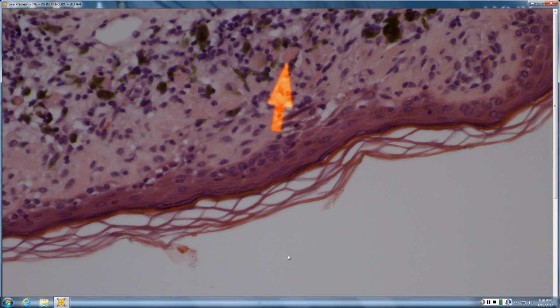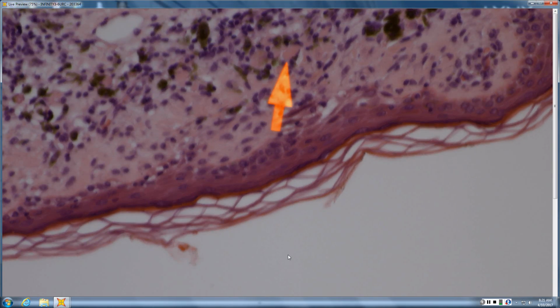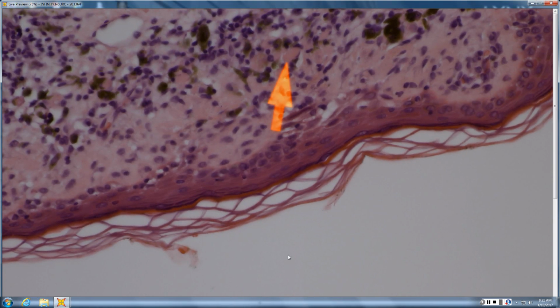So this is a late stage of a lichenoid dermatitis. Tell me things that can cause a late stage of a lichenoid dermatitis. Lichenoid GVH. What else? Lichenoid regression of melanoma, if it's broad on sun-damaged skin. What else? Like an old ashy dermatosis, something like that. An old ashy dermatosis, which is basically the same as lichen planus actinicus. What else? Like a burnt out LP, burnt out lichenoid drug, burnt out benign lichenoid keratosis, basically your whole lichenoid list. Even lupus and dermatomyositis could be in there.